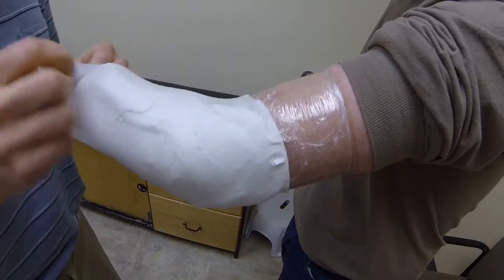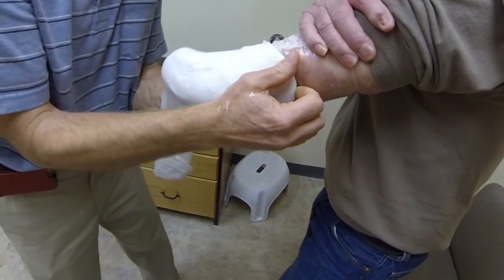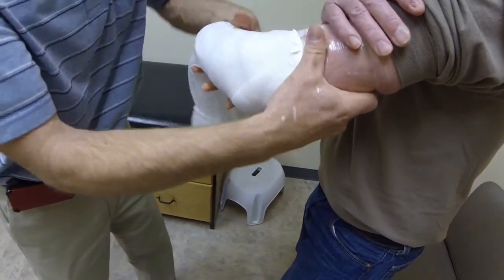Remove and inspect the plaster impression. The cast is now ready to be filled with plaster. Cast modification will be demonstrated in another video.